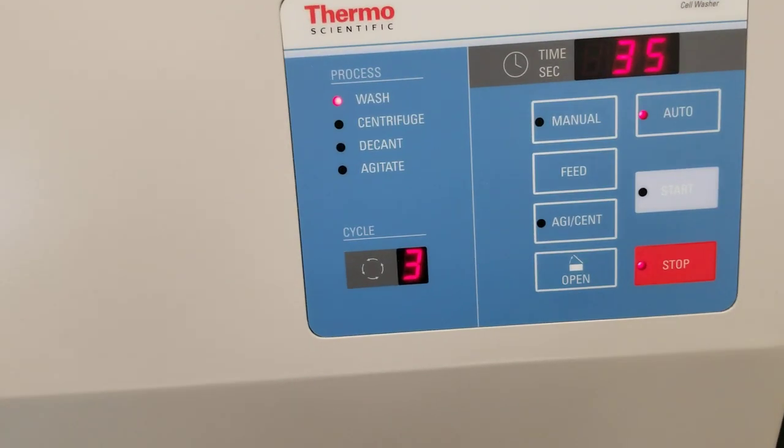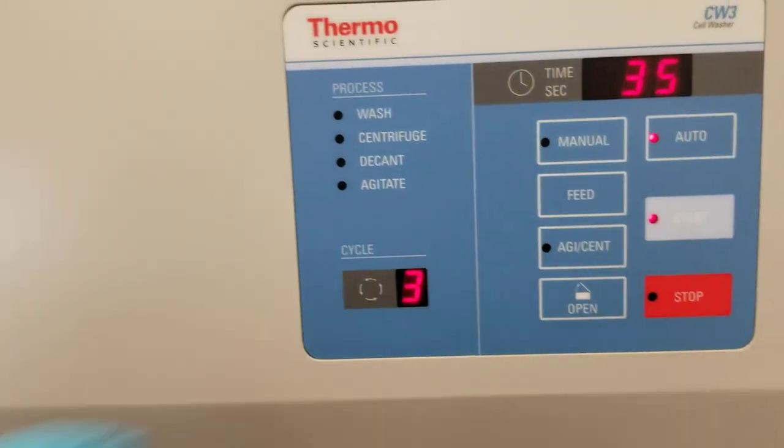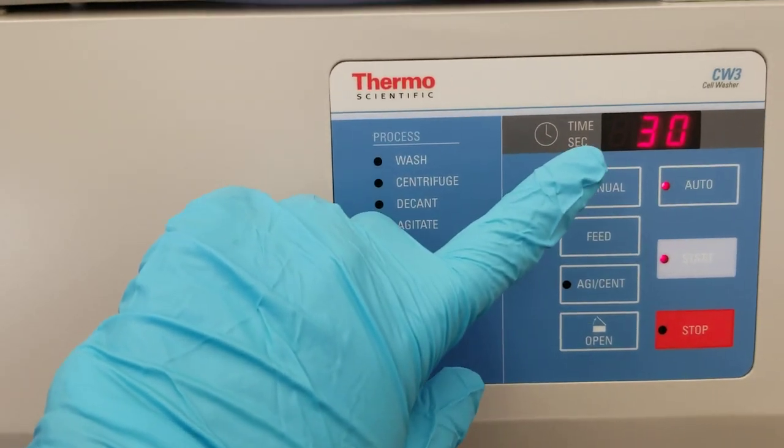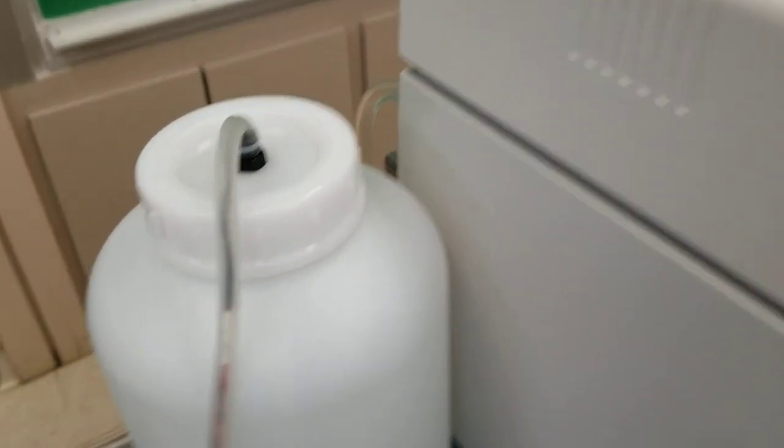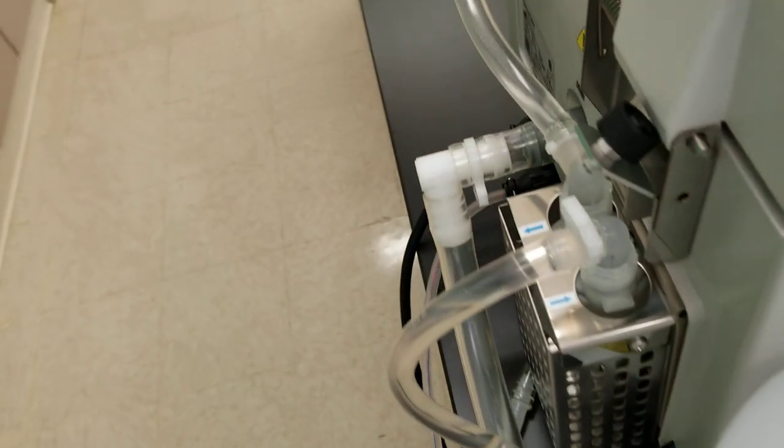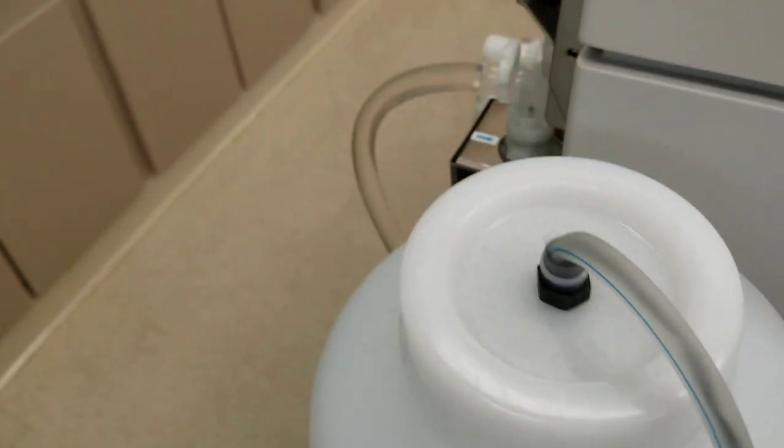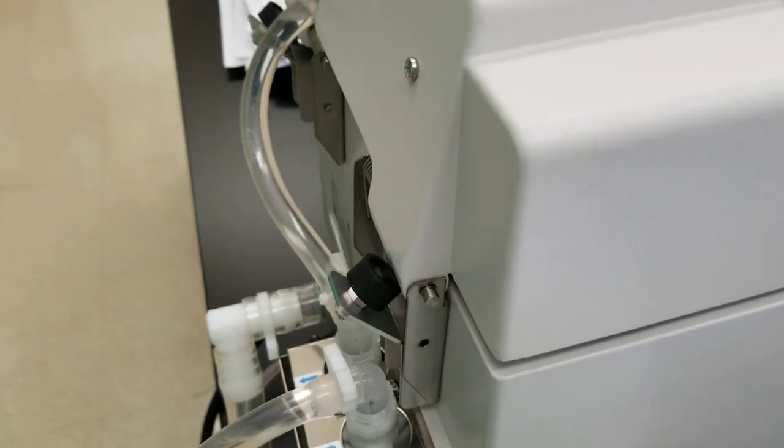So in order to get it started, we need to press this light blue. Okay. Now it's showing it's washing and it's telling you how much time it's going to take to finish washing. You can hear the saline coming out from here and going into the cell washer. Okay. And before you do any of this, you want to make sure that there aren't any bubbles in the tubing because then it's not going to be done as well. It's not going to be very accurate.